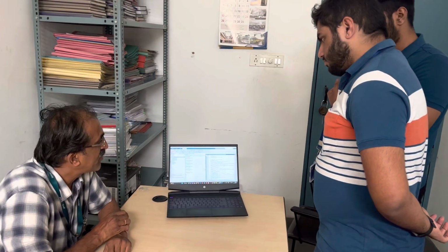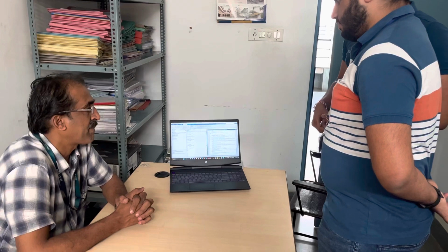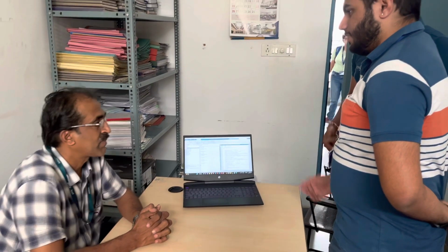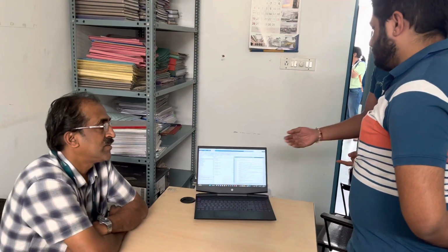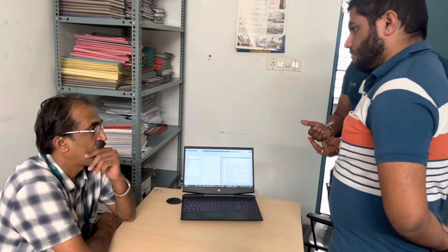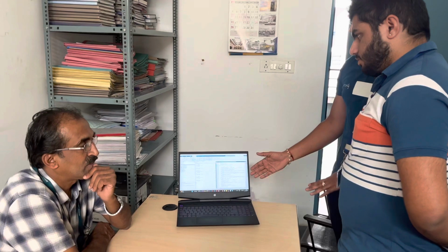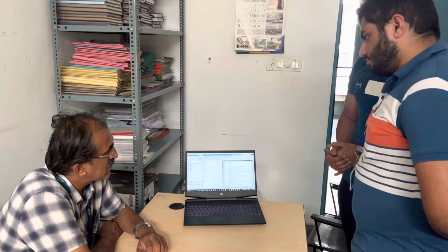What was the main learning from this self-study? Self-study was mainly the MATLAB code, how to load data from the library and how to use a particular function. We also learned more about filters. By testing with the Hamming window and the rectangular window, we saw that the rectangular window is more optimal for this particular application. We also studied FIR filters.